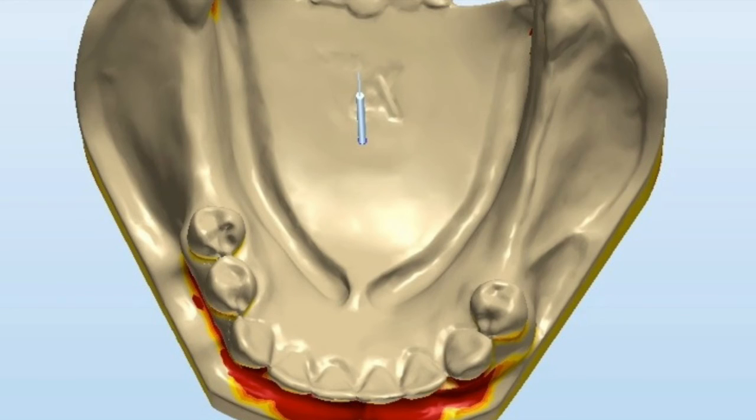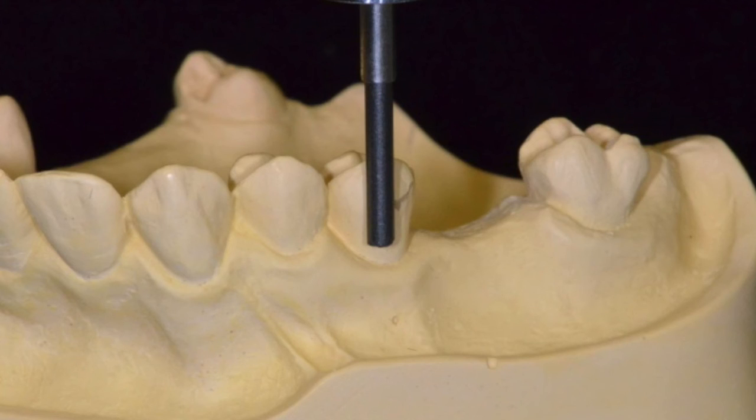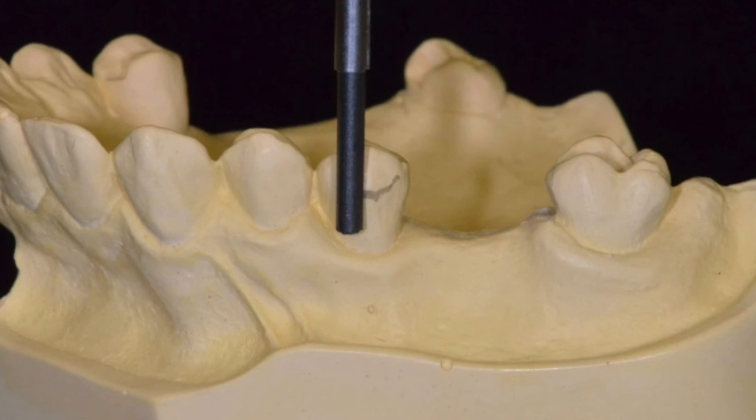This is another mandibular cast, determining the lateral tilt. And again, the same thing, you want to look at the equalized undercut amount on the right and left side of the last abutment tooth. So when you look at this color, you can notice the equal amount of undercut present on the last abutment teeth. Then using the carbon marker, mark the height of contour, which is called the survey line, on the abutment teeth, the tooth that will have a clasp component.